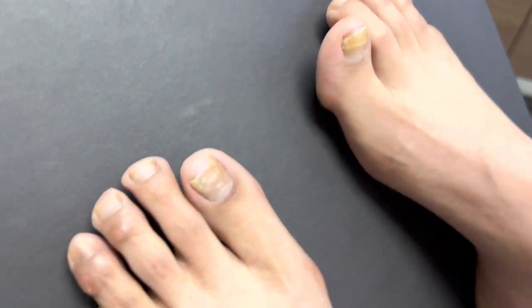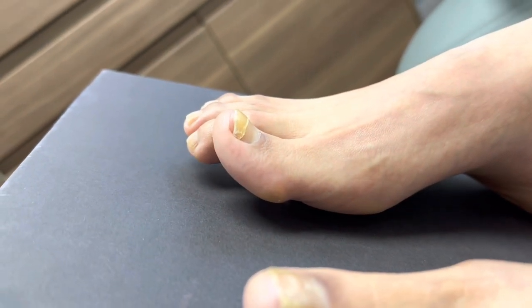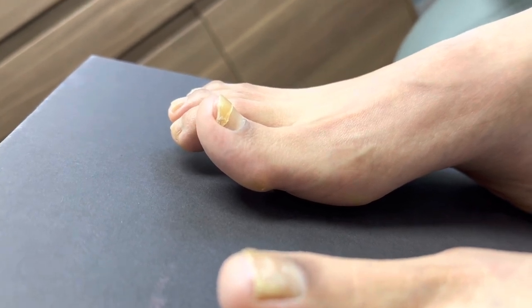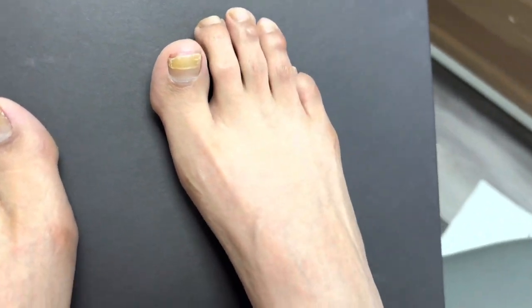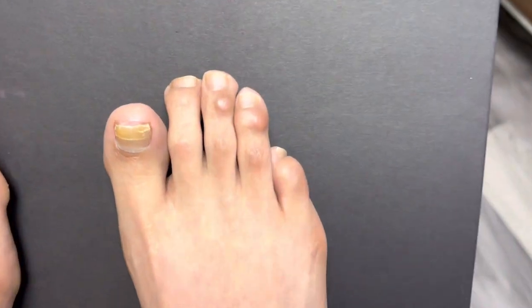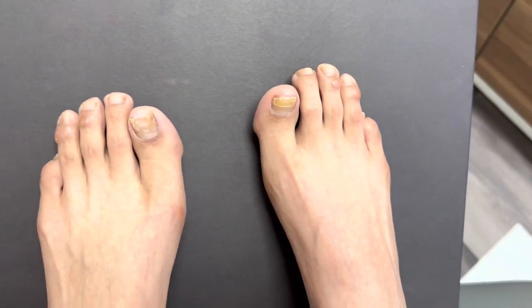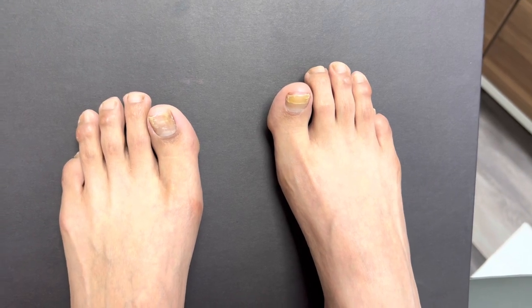As everyone can see here, this is what I mean by the big toes — they're kind of raised like that. That's called a hallux extensis. We're going to go ahead and bring that down. We're also going to excise the unsightly lesions. This is going to be a beautiful transformation, and I think everyone's going to enjoy this tremendously.